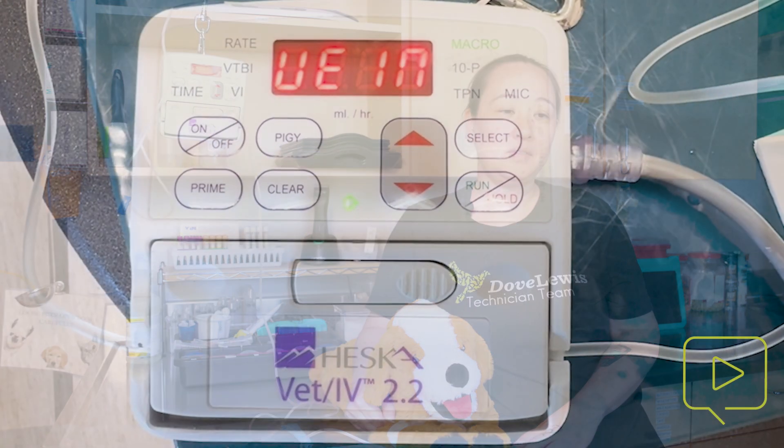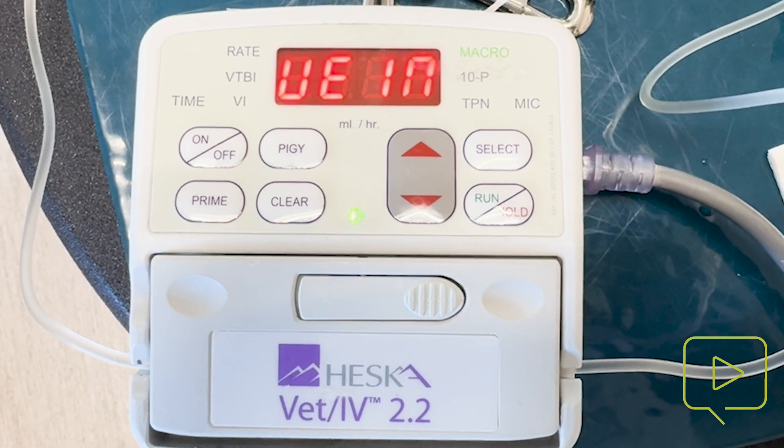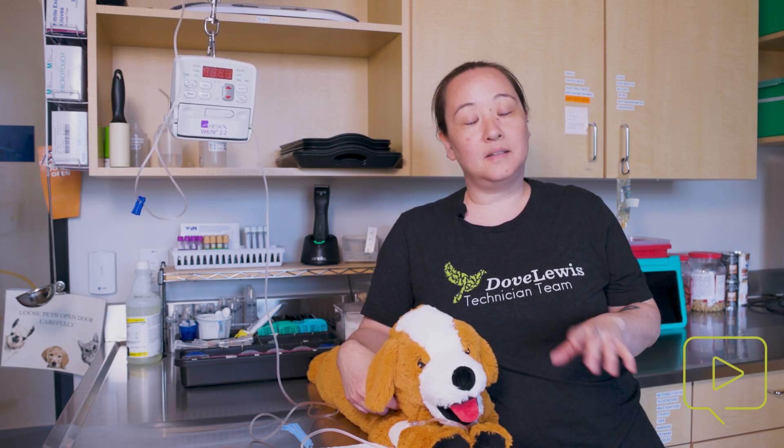The next alarm I'm going to cover is called the open vein alarm. Here's another quick video of what that looks like. What this means is that the volume to be infused has been reached. When you set up your fluids, you tell it how much volume you want to go through — say 500 mils. Once that volume has been reached, it doesn't just turn off because that may cause your IV catheter to become non-patent. So you need to reset the volume to be infused so it will deliver the appropriate volume to your patient.